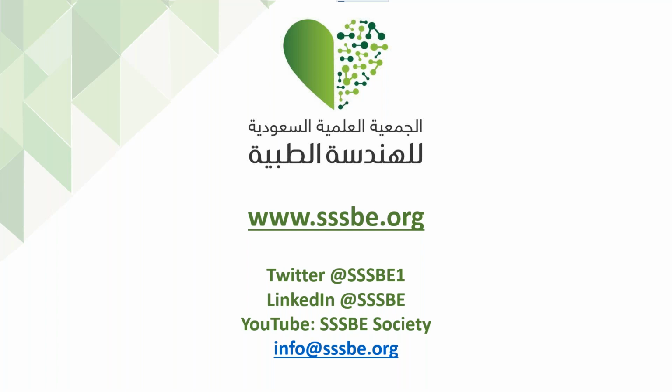And the last question: if I change the color from red to blue, after that, how will I know whether the blood goes towards or away? I hope my question is clear. And it is. So basically, there's an indication on the side of the screen that shows you the up and the down. It's like a scale, and you can flip it, and you will see the result.